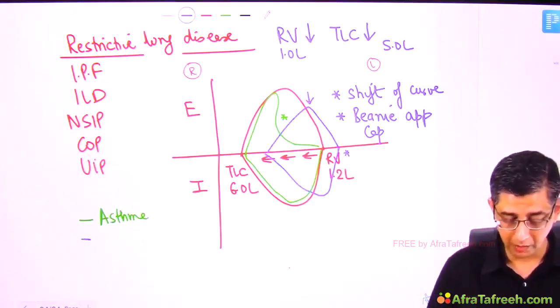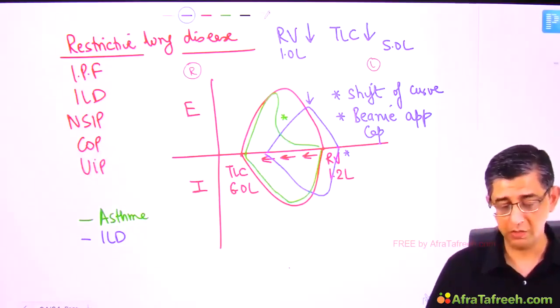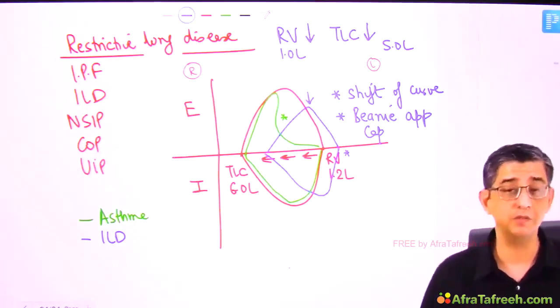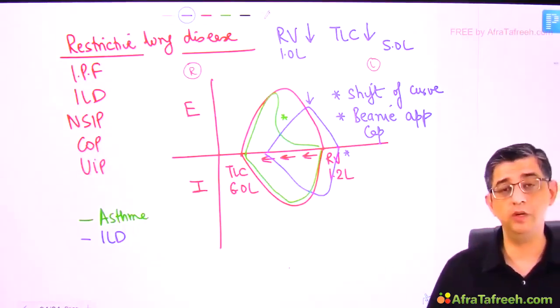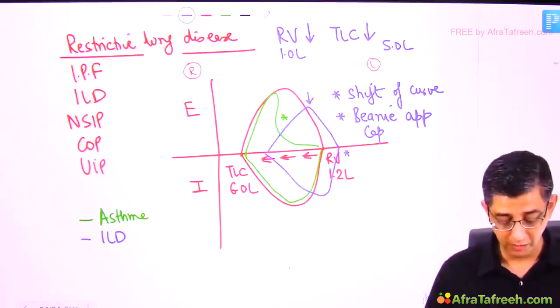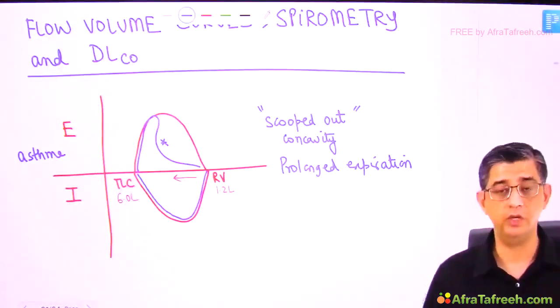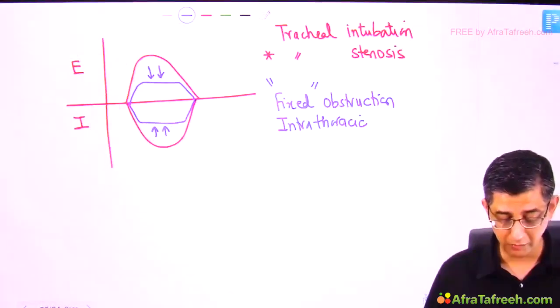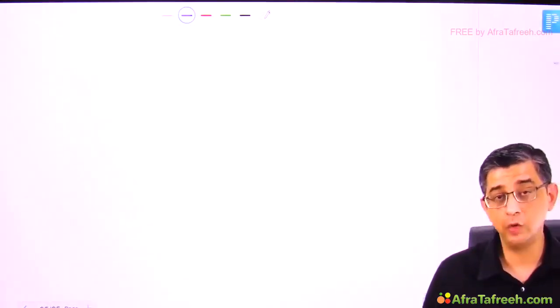The blue marking is representing interstitial lung disease, and the red is representing the baseline. And if you just remember this much of information, it's more than sufficient to crack these questions that can be coming. The only thing is, he can trouble you with words like intraparenchymal, extraparenchymal, intrathoracic, extrathoracic. But if you just get the basic concept right for the diagrams that are drawn before you, if you just sketch them once, I am very sure that you will be bang on track to identify questions on flow volume curve. Next, I shall be describing some mathematical aspects related to spirometry.